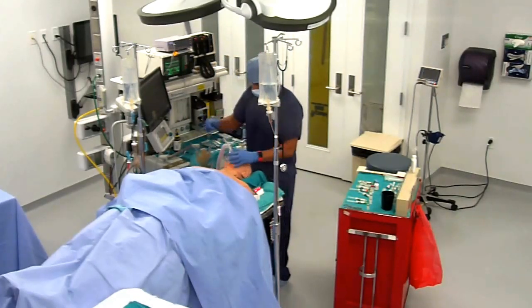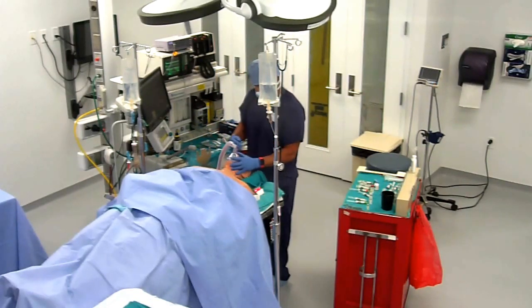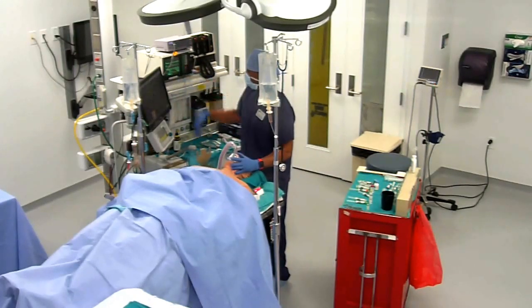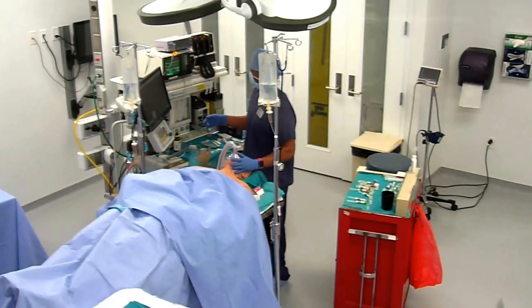All right. So I want to just help the patient breathe a little bit. Take some deep breaths for me, Katie. And I want to assess what she's pulling on her CO2 and her tidal volume. And assist her. She's breathing now on her own. All right. So you got CO2 up there. Mm-hmm. Okay.